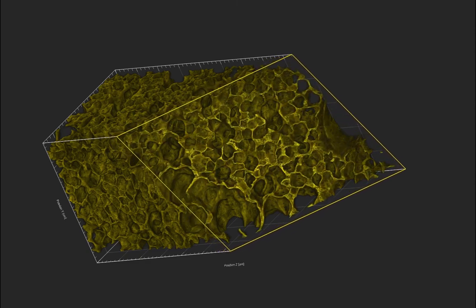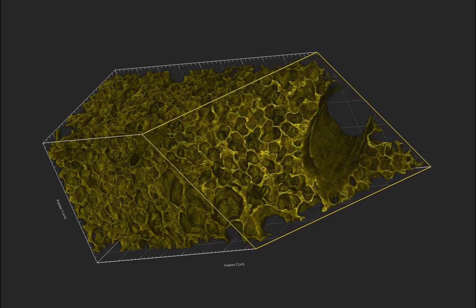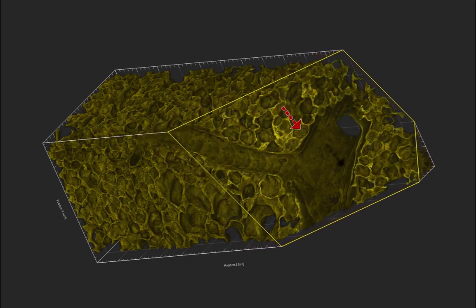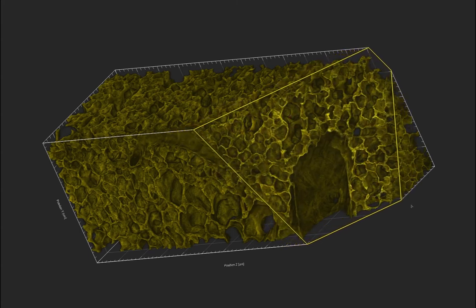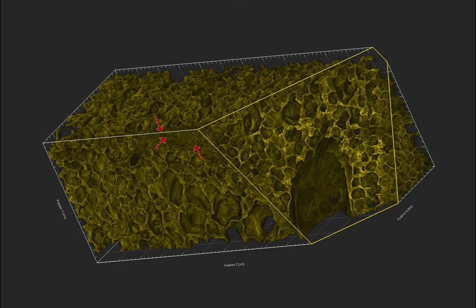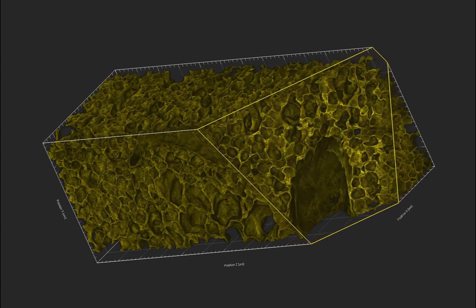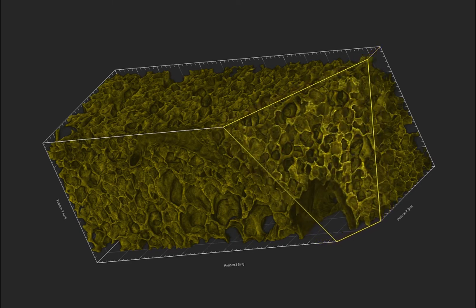So as we zoom back out to the origin, we see the pulmonary vein appearing, and now we see the pulmonary side vein, and all these little holes in the side of the vein are the pulmonary venules collecting and dumping into the main vein, and then that dumping into the collecting vein. And that hasn't been very well seen before.